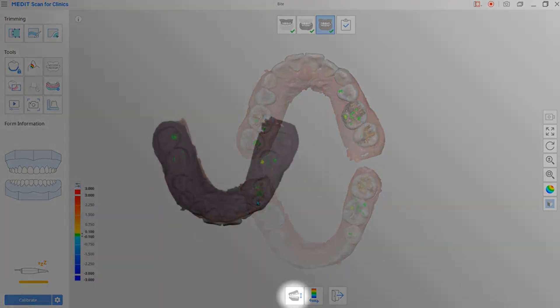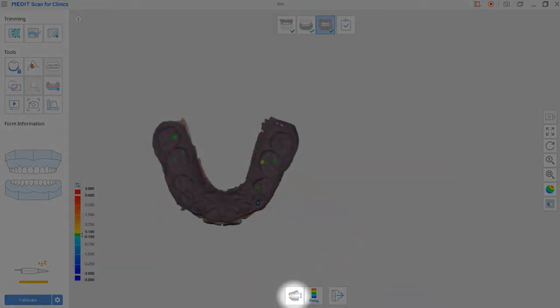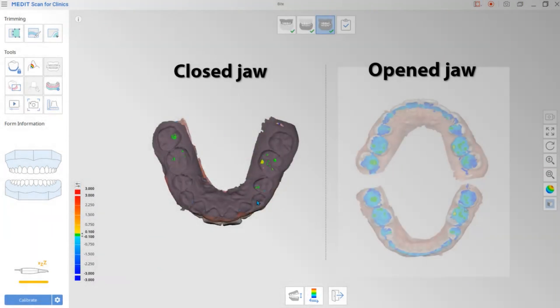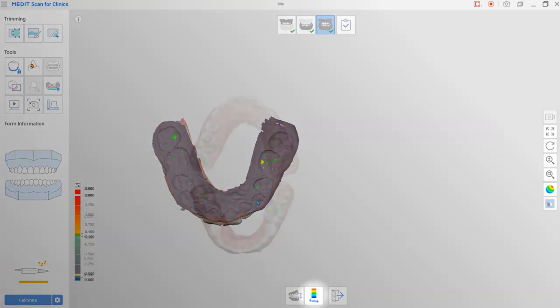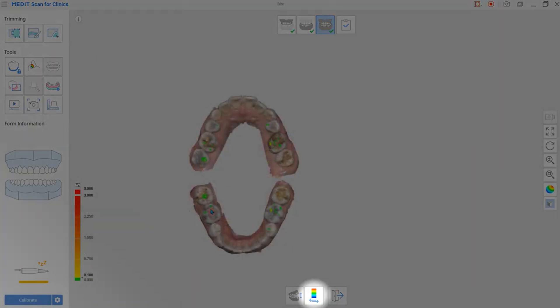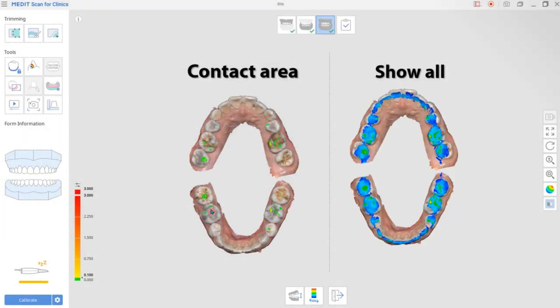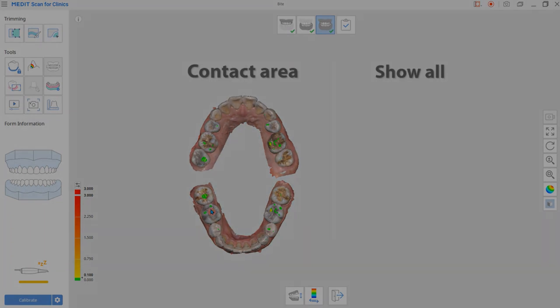You can select the view style between opened jaw and closed jaw and confirm the occlusal contacts. You can also choose the color deviation style between contact area and show all.